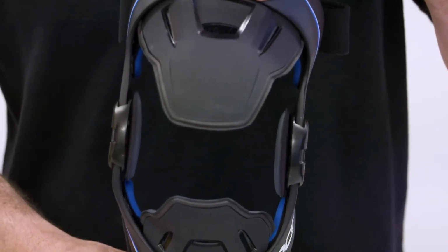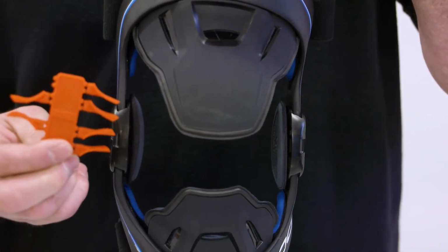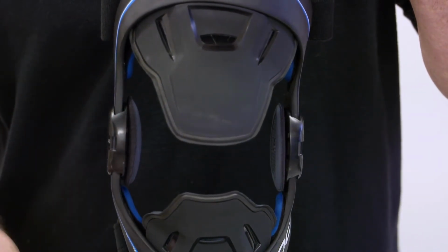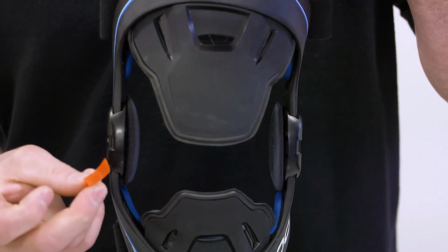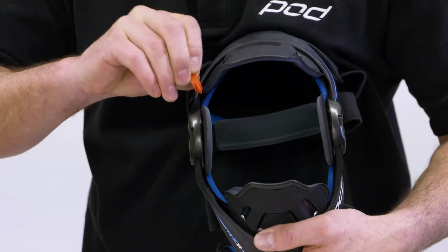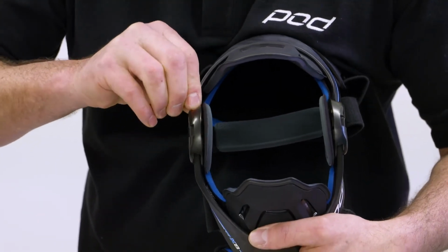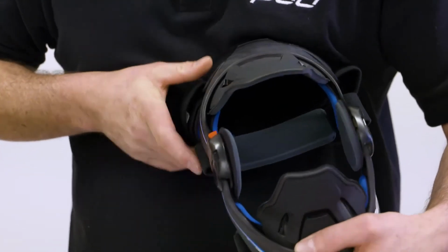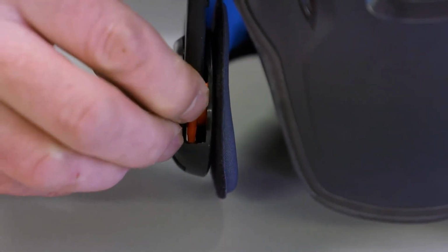Within your brace bag, you also received some hinge stops. They assist with the earlier lockout. There's thinner and thicker. So we're going to insert the thinner versions in the right housing of this brace. So you can cut them away from the original card and then you'll bend your brace. So fully extend your brace and then you can insert the thinner or the thicker stop into the top frame first, and then we'll repeat that with the lower frame.